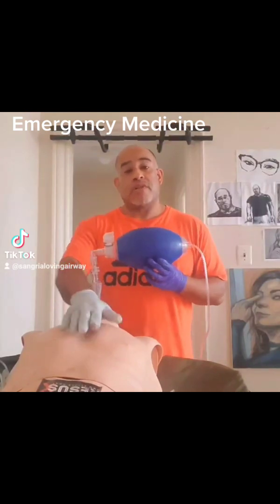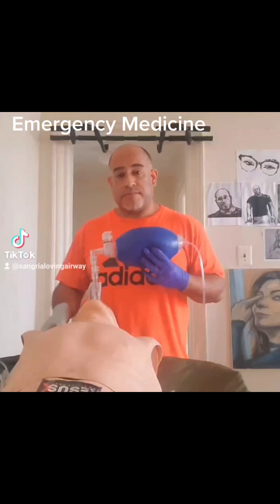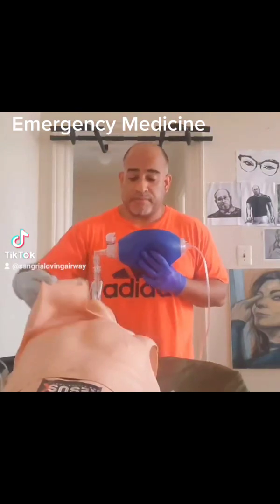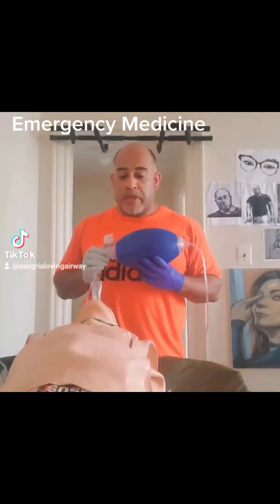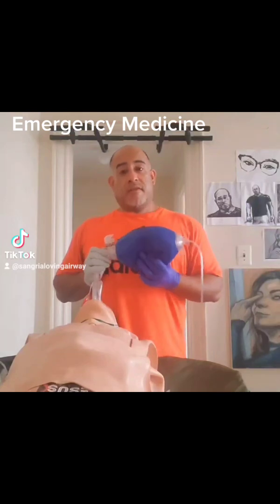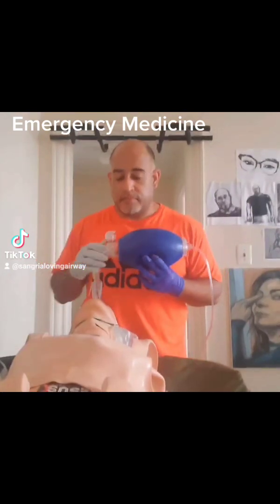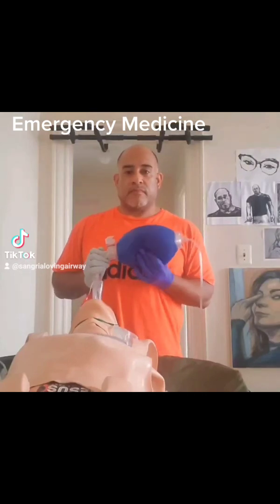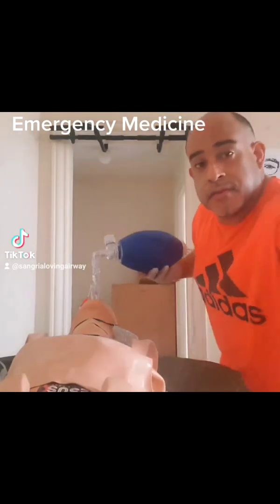And then you think, oh, it's just aerating air in the belly. No. I'm gonna show you something. You can't do this with our patients, but look, chest wall rise. And if you don't believe me then, patient has balloons for lungs.